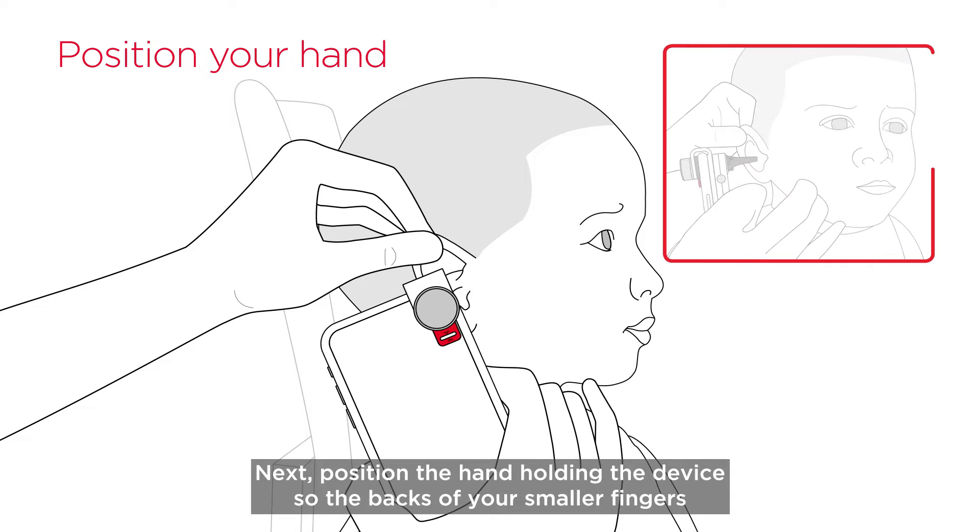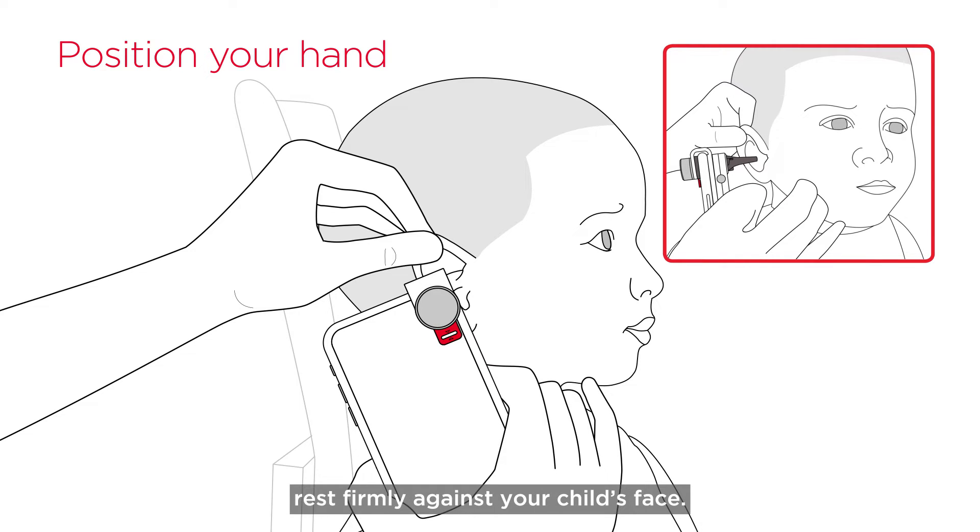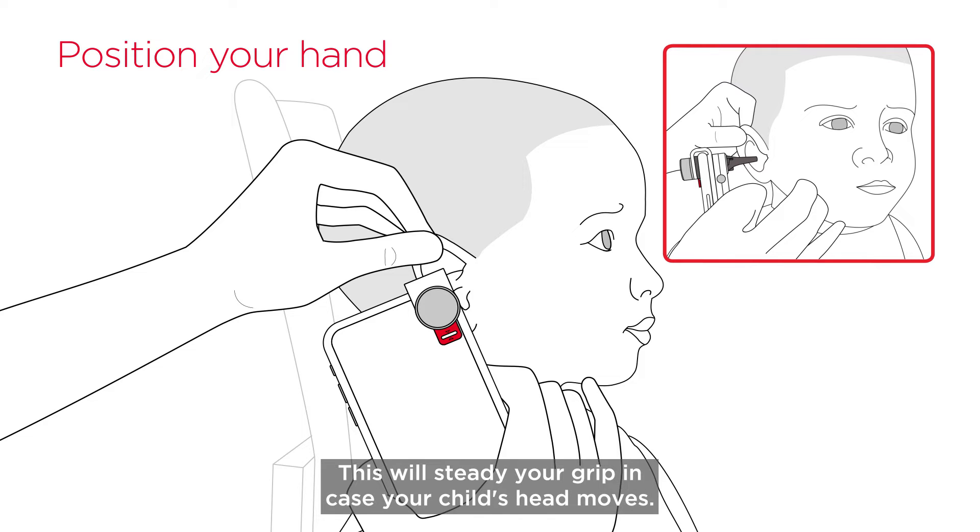Next, position the hand holding the device so the backs of your smaller fingers rest firmly against your child's face. This will steady your grip in case your child's head moves.